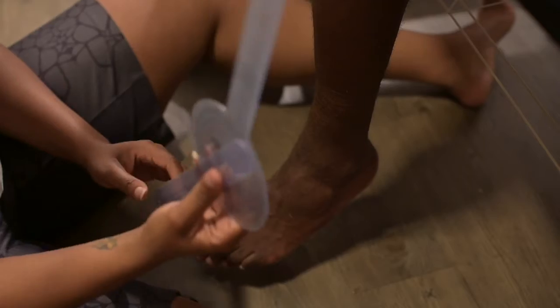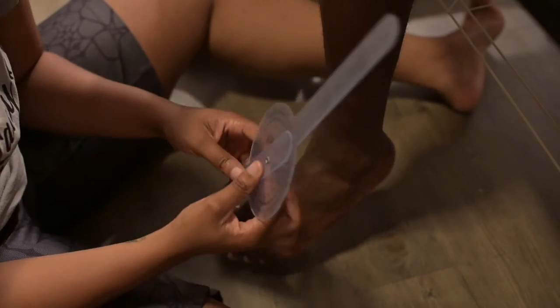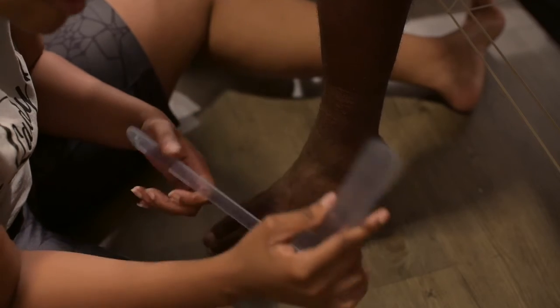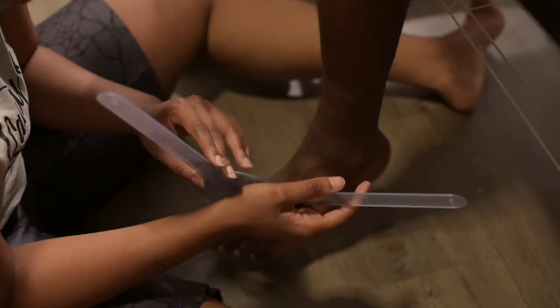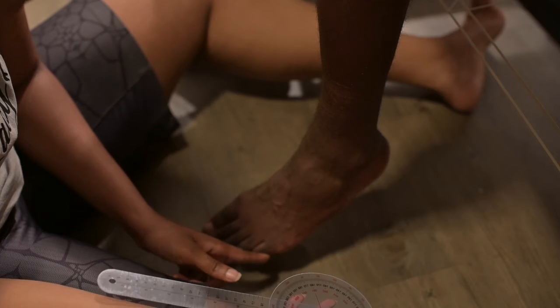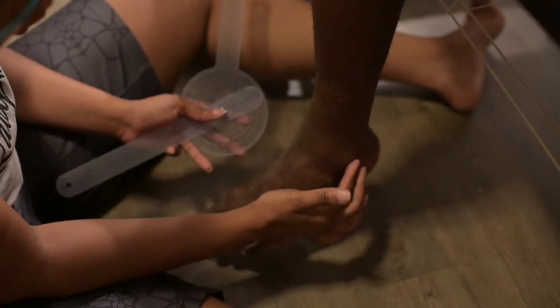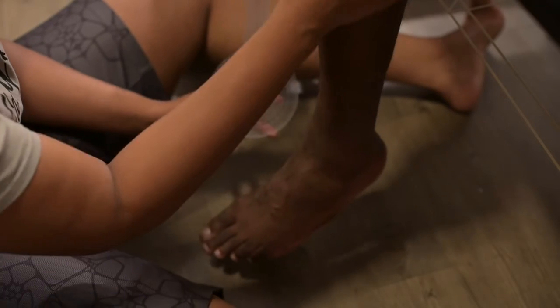All right. So the axis of rotation is at the lateral malleolus. The stationary arm aligns alongside the fibula, and the mobile arm aligns with the 5th metatarsal. So we want to palpate, here is the lateral malleolus, and we want to palpate for the fibular head.